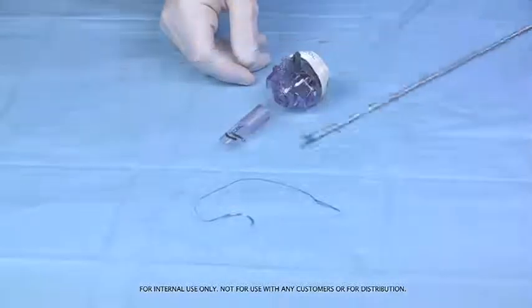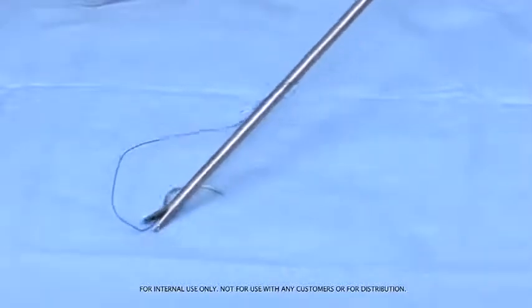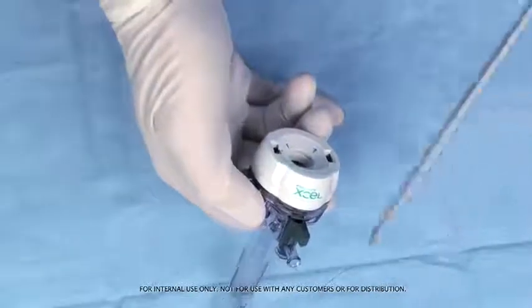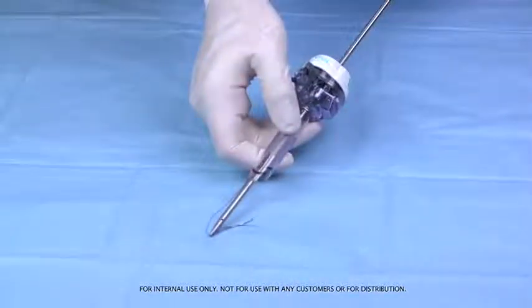Begin by passing the endoscopic needle holder through the adjustable fixation loop on the Stratafix spiral device and grasping the leader zone of the device, located approximately one to two centimeters from the needle swage. Using the needle holder, insert the needle and Stratafix spiral device through the trocar.